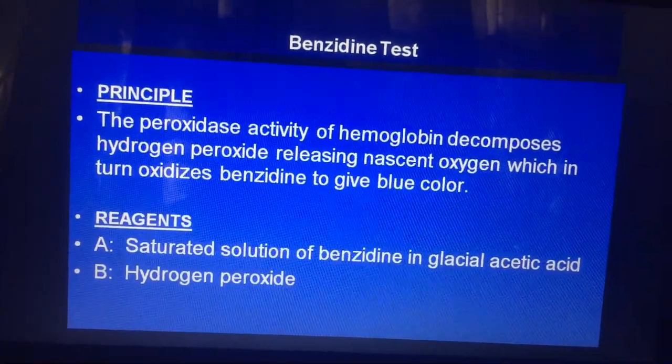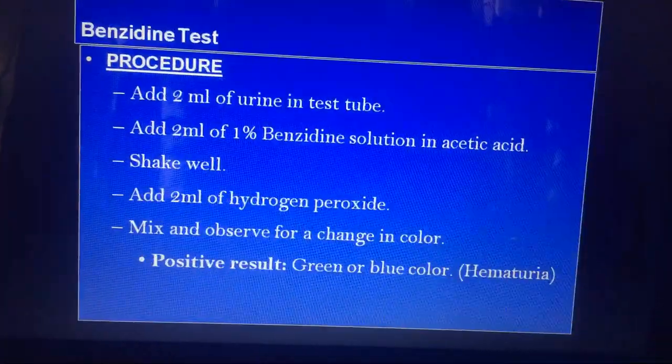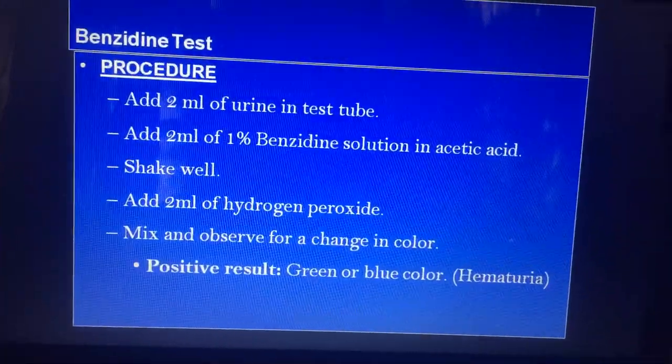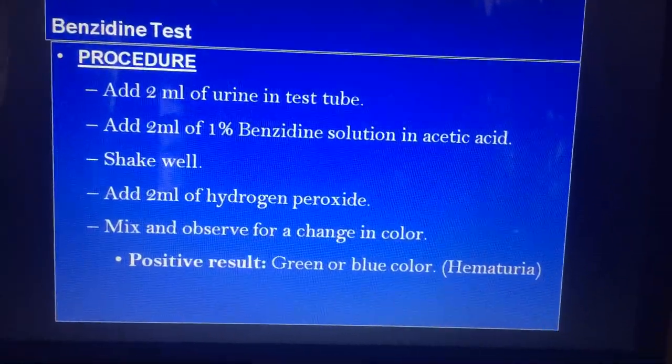This is the benzidine test and its procedure.